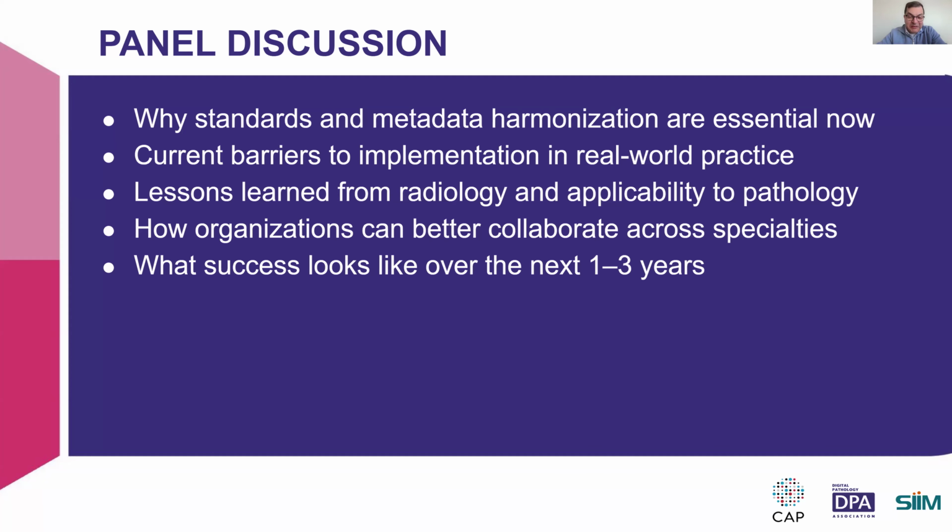Yeah, I already mentioned that we really need all the vendors to use native DICOM only, with no proprietary formats. Vendors should demonstrate DICOM conformance as a baseline procurement requirement. That's a must.